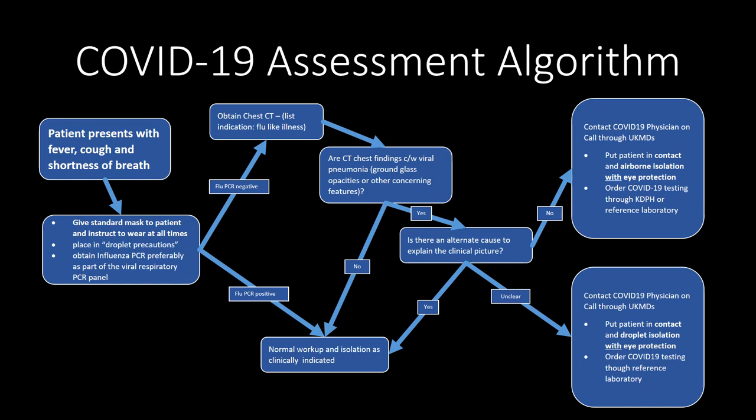If the CT findings are negative, then that patient will go back into a normal workup algorithm for respiratory distress or upper respiratory infection. If the CT findings are positive or classic for a viral pneumonia, we will then look for any alternative causes to explain the clinical picture.